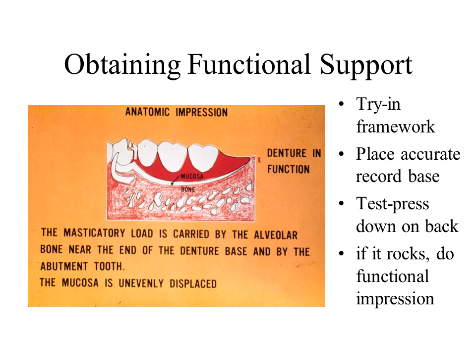How does one determine when to employ the altered cast impression? To test the need for an altered cast impression, one should first fit the framework. Then, importantly, one should attach a light-cured base onto the edentulous denture base retentive element, and reseat the partial denture. When accurately seated, press down on the most posterior aspect of the denture base. If the partial denture rotates about the fulcrum line, then an altered cast impression should be considered.